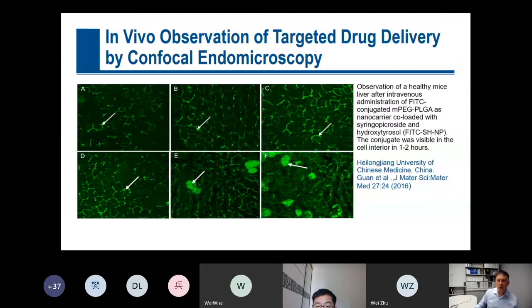The images show the binding of nanoparticles to the cell membranes and, over time, the delivery of the contents of the nanoparticles into those cells. The time course of this experiment was around 2 hours. So you can see you can get good stable images over an extended period of time in the same animal and study active processes.